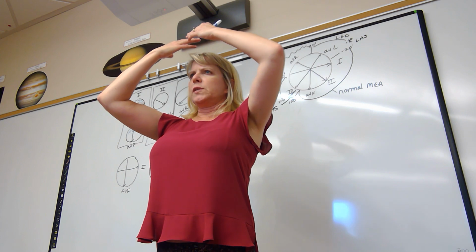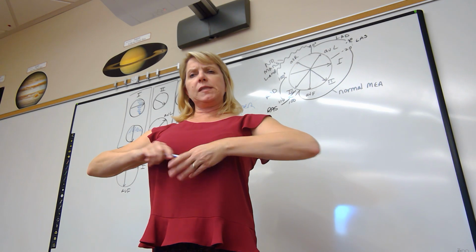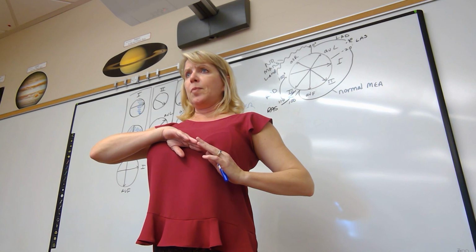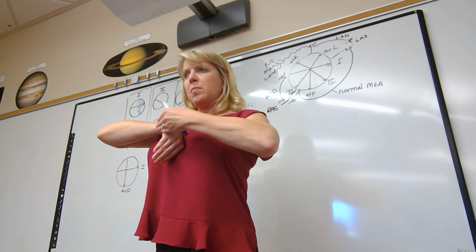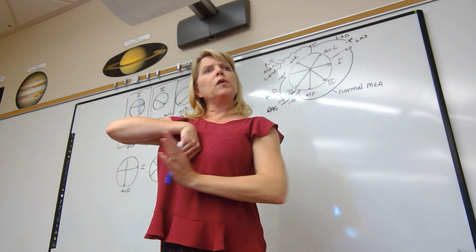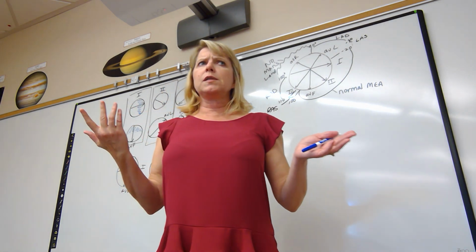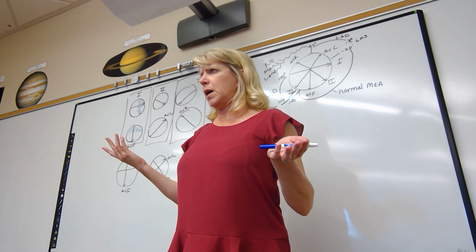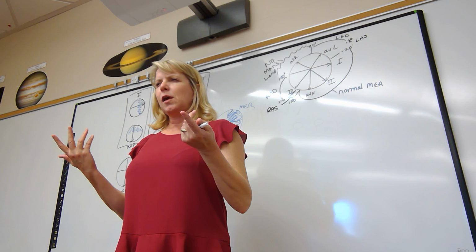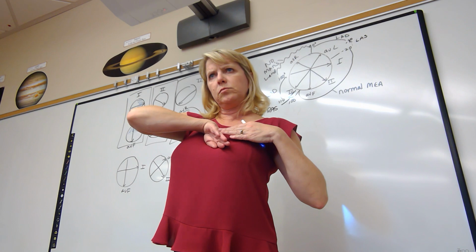Some people are just naturally tall and slender and lean. So their diaphragm might be sitting anatomically more inferiorly. And again, the apex of the heart is connected to that. It might be more vertical in the thoracic cage. So they might have a more right-sided MEA. It does not mean that we say, oh, you're diseased, we should do something about it. We ask these questions, we think about it. Does that make sense? So are you an ectomorph where everything is more vertical, like Cole?